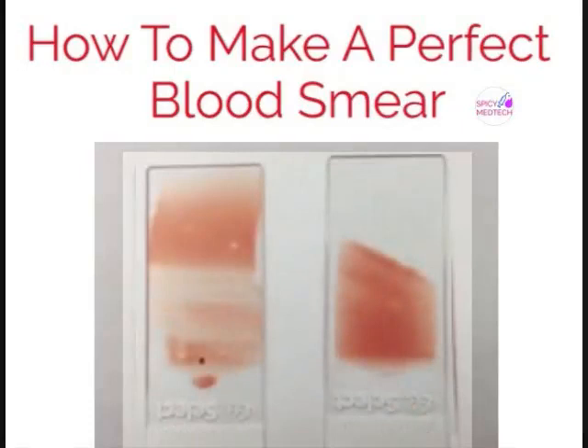This fourth pair shows what happens when the pressure is too hard or too light. When done too hard, the smear is expected to have ridges. If done too gently, we can expect that blood will not reach the end of the smear.